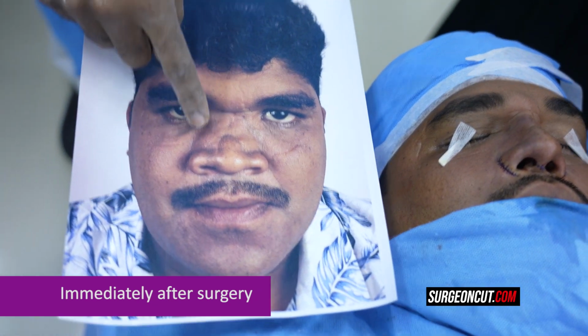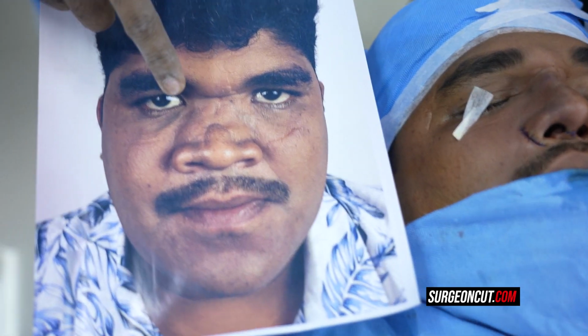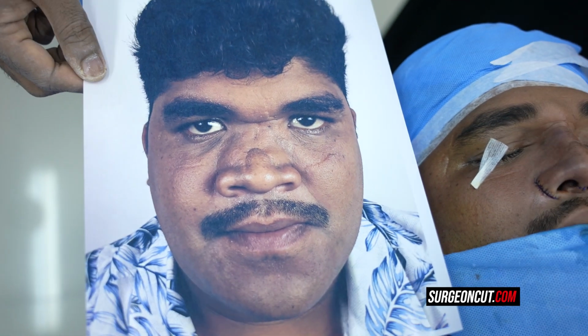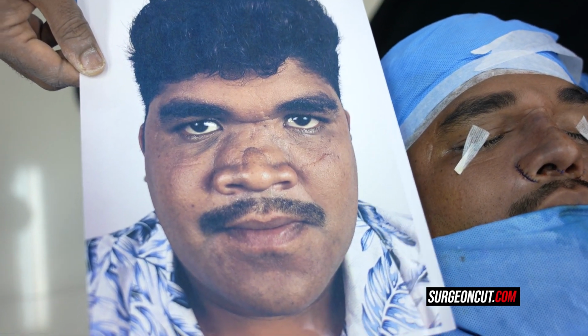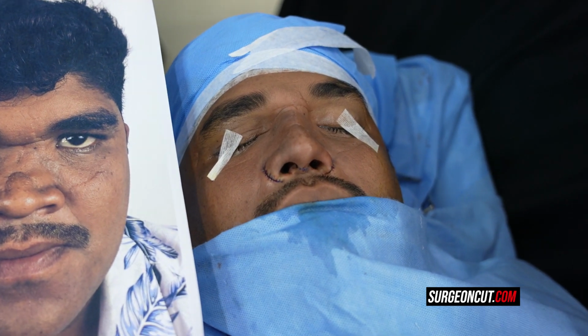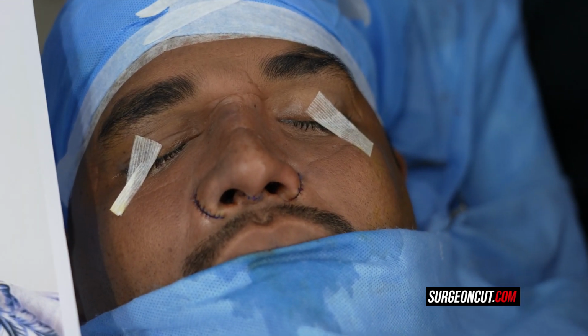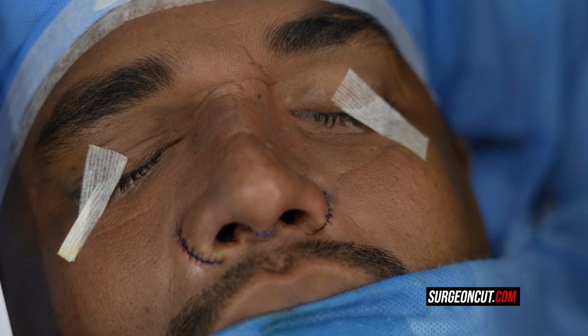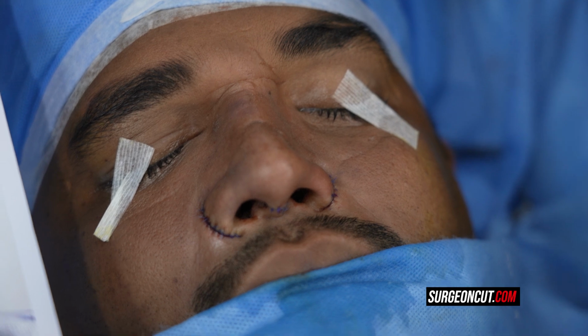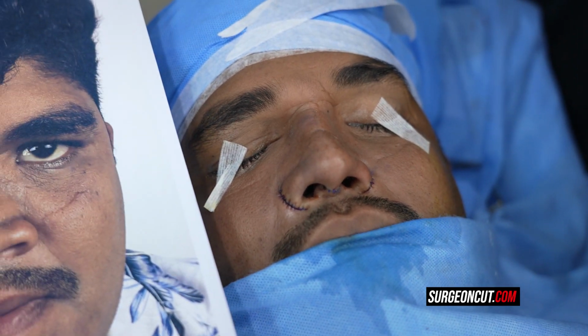So he had a major accident several months ago, and this was in a different city, and this is all the scars from that. And he had issues with the medial canthus, and obviously there's no nose there. A lot of problems with the septum too, no support as well. And that's the treatment: reconstruction, rib harvesting, rib augmentation, septal reconstruction, spreader grafts, and also a lot of marginal rim grafts, alar batten grafts, and tip graft.